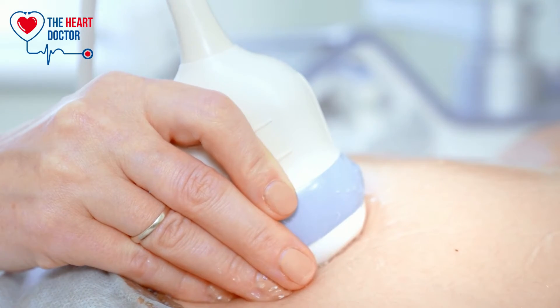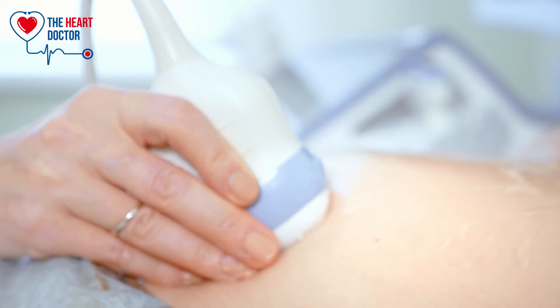A gel is used to help the sound waves reach your heart — it can feel cold and sticky but is otherwise harmless. The healthcare professional doing your scan will be either a cardiac physiologist or a doctor. They will move the probe in different areas of your chest around your heart. The probe emits high frequency sound waves which pass through your skin to your heart. You will not feel the waves going through, but you may hear swishing noises from the machine, which is the ultrasound waves bouncing off the structures of the heart and the sound of blood flowing through the chambers. It's a very safe test and most people find it's not uncomfortable, although you may feel a bit of pressure as the probe is pressed onto your chest to obtain the best images. They may also ask you to hold your breath or adjust your position slightly to optimize the images.